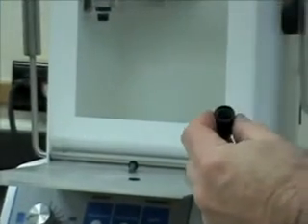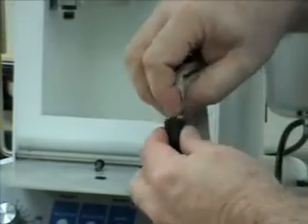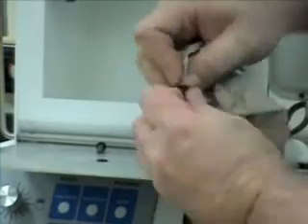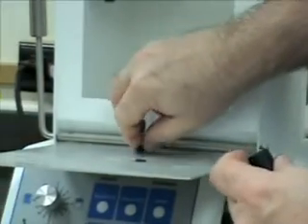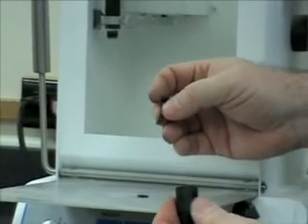If you have a fine paintbrush or just the tip of a paper towel, you can wipe the inside of the housing and maybe tap it lightly on the door for any dust removal. And then reassembly. This is very important.